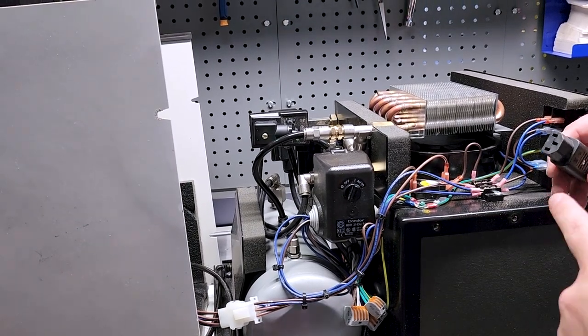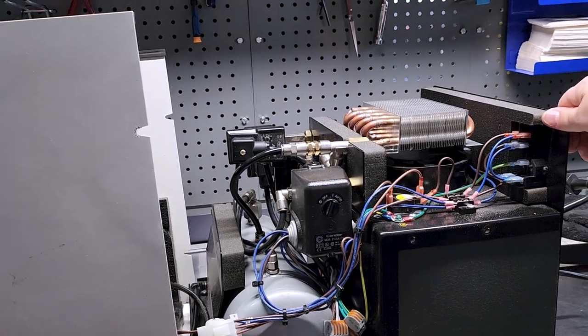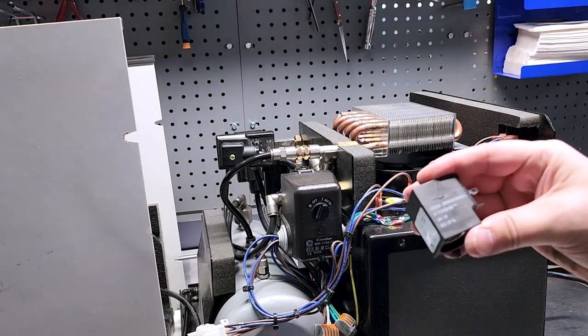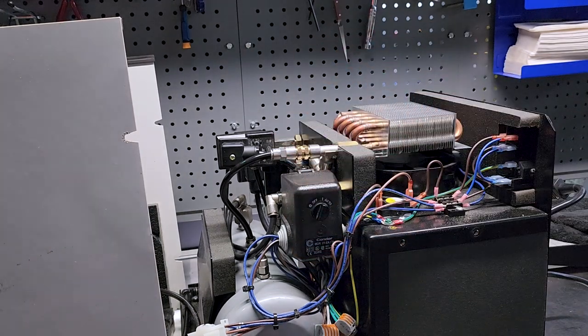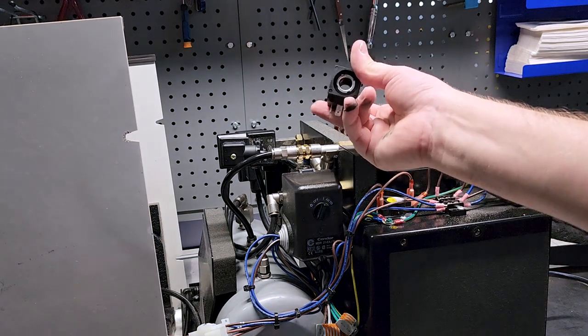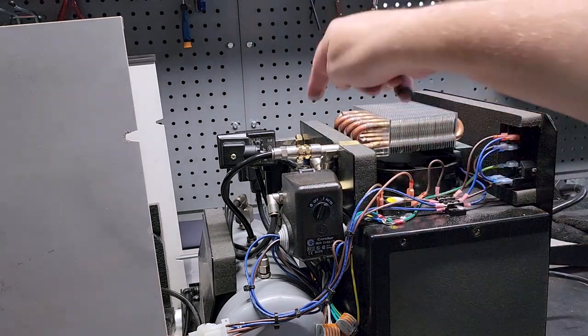So this is one of those situations where if the ground plug was broken and we were in here touching anything, even the edge of the case right here, I would be getting absolutely lit, because it is arcing mains, which this guy operates on mains. You can see right here, voltage 115 volts. So it's arcing mains over to chassis, which is ground. And that is the arcing spark sound that you hear. When you energize a coil and when you de-energize a coil is when there are two voltage spikes internally. And those voltage spikes have broken through the insulation. You can kind of see it inside the body right there. You can see the dark spots where it's arcing away to ground.